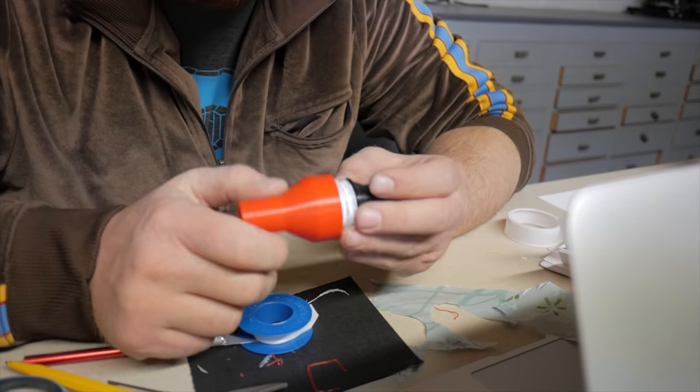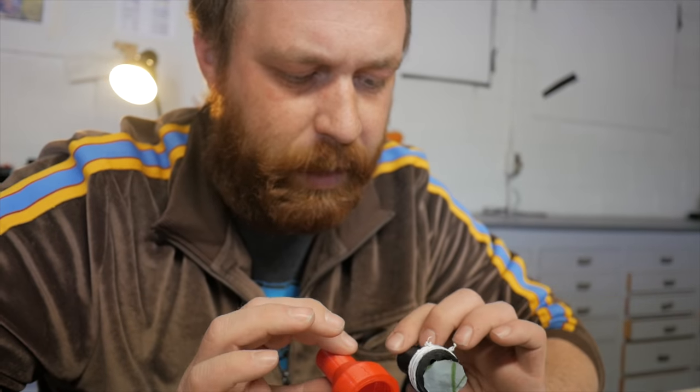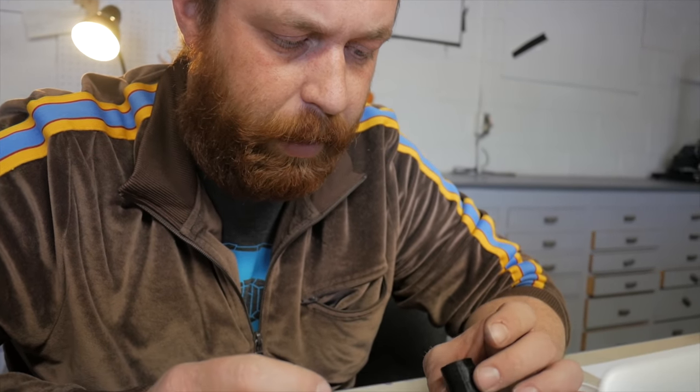The deal with this is it's speed of design too. We have an emergency coming up, so I don't think I'm going to optimize this into the best check valve of all time, but by midnight tonight, I will have a check valve that people can print and use as part of their ventilator machines. Then maybe we can move on to O2 and air mixing valves, air humidifiers and bubblers, or what's interesting to me, piston pumps or peristaltic pumps of some sort.